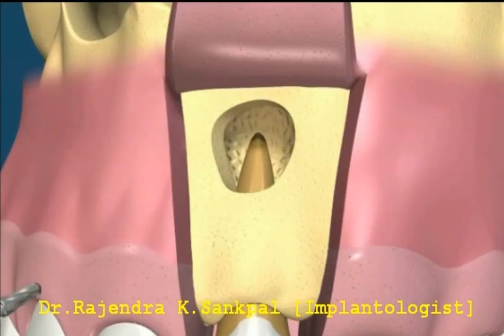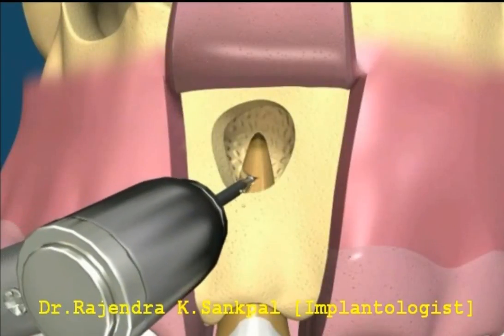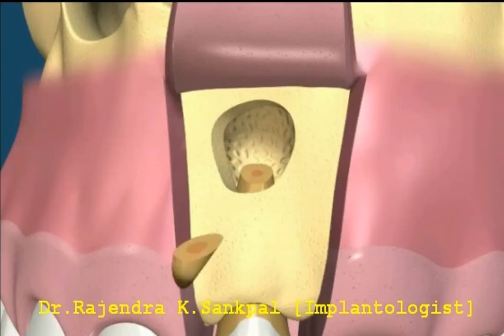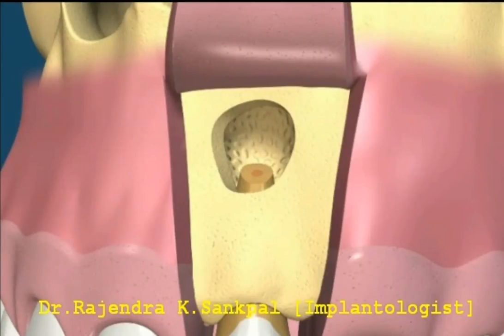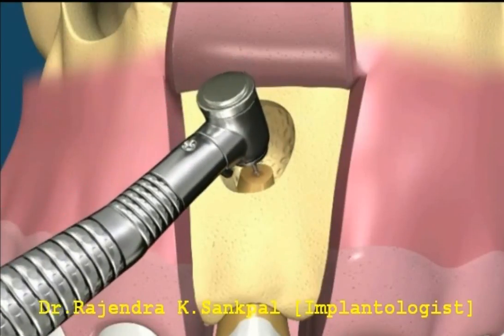To prevent reoccurrence, the tip of the root is sectioned. Then the root canal opening is prepared again with special small drills or ultrasonic instruments.